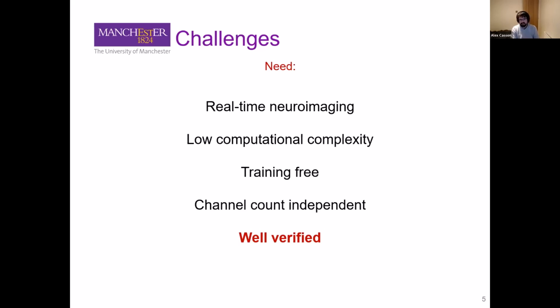There are some papers out there that look at collecting a whole load of EEG plus artifact data. You learn the shape of the artifacts, the typical transfer function that you get, and then you can use that to remove the artifact. But that's not amenable to closed loop paradigms, because every time you change the stimulation, you've got to change your training, you've got to redo that step.